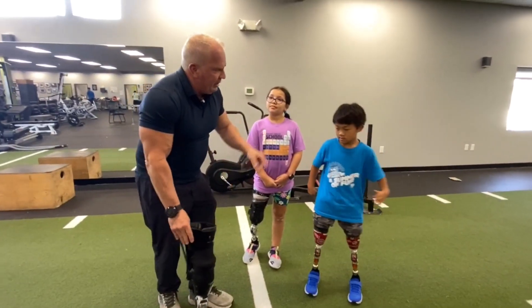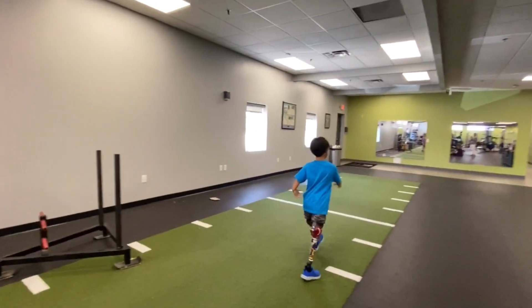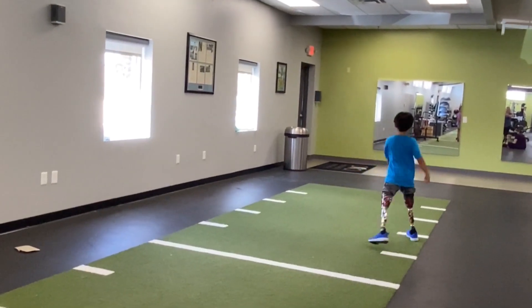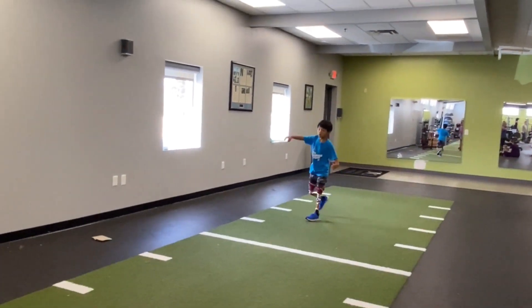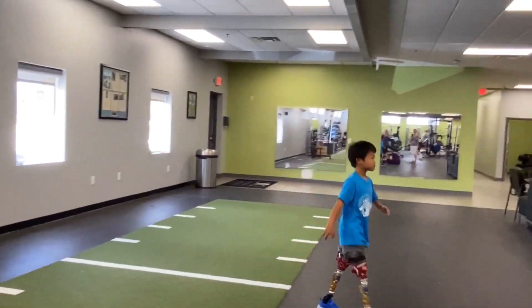If we watch — go ahead Charlie, walk down there for us real quick. So if we watch Charlie walk with it. Come on back. Charlie, can you walk sideways over here? So he's able to do that.